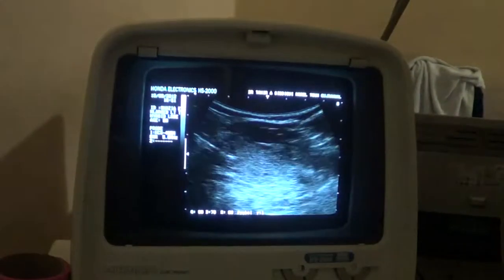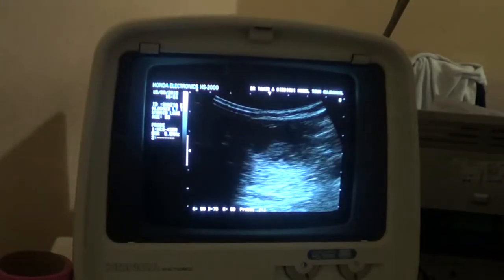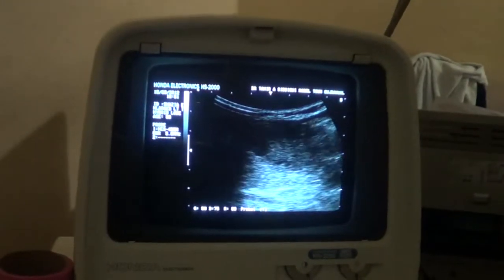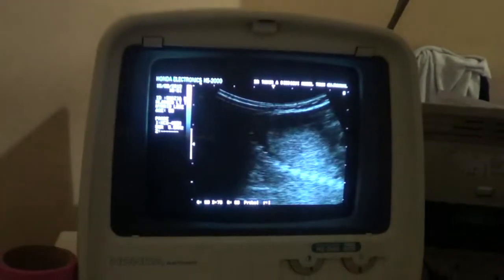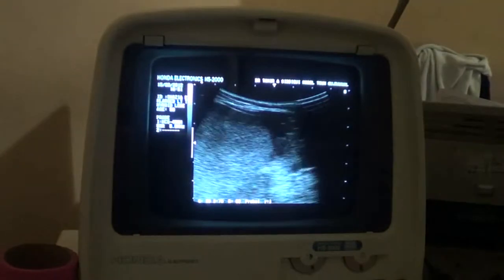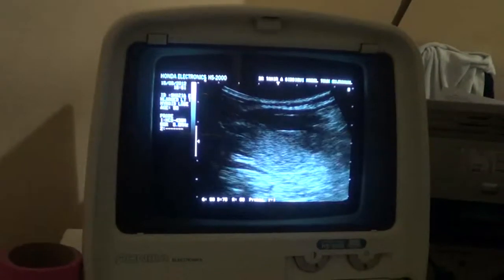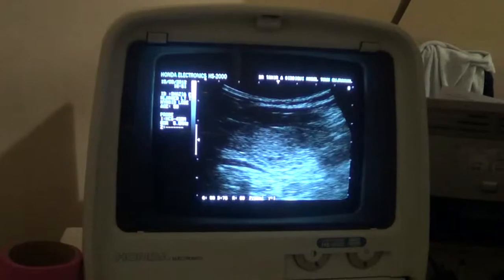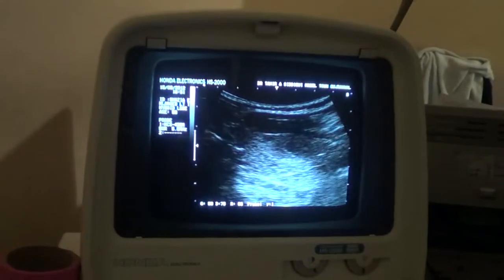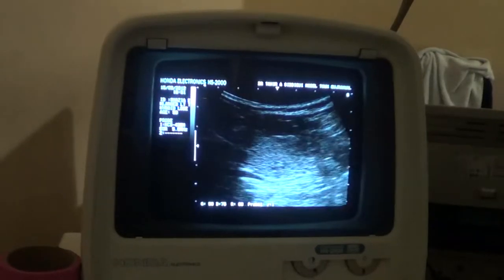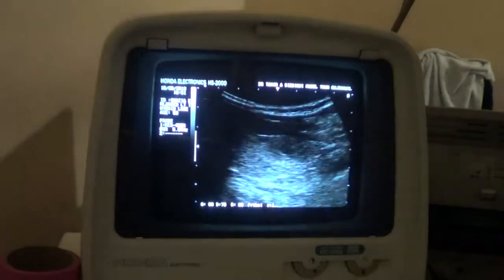Now I am going to rotate the probe 90 degrees so that I can get the thyroid gland in transverse section. This is the right thyroid gland — sorry, left — this is the left thyroid gland, I am sorry.